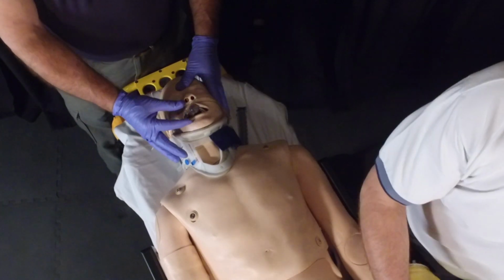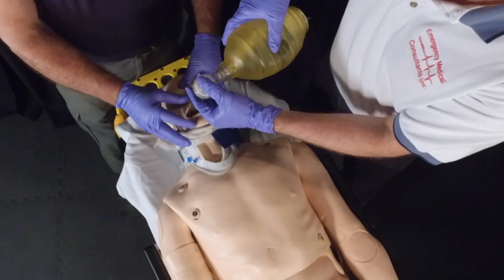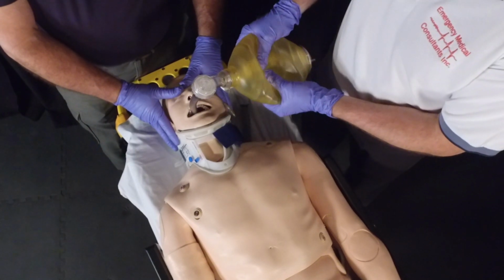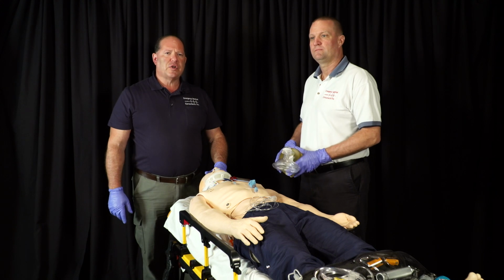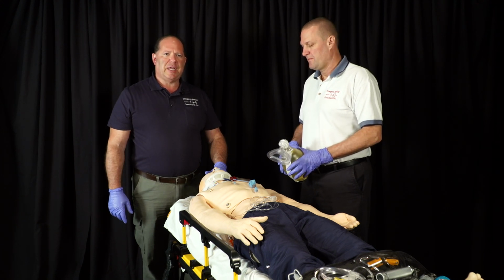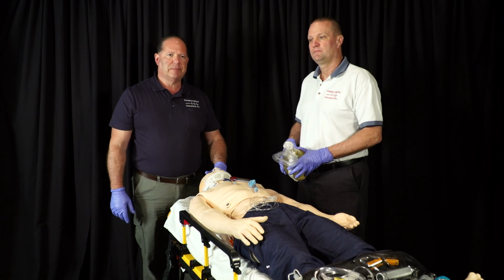You notice that the device moves up a little bit as it seats itself, and the patient is then ready to be ventilated. Quick, simple, without much need for airway movement. There are several versions of those LMAs. Some allow you to intubate through them. Some of them have a cuff, some don't have a cuff, some are different shaped.